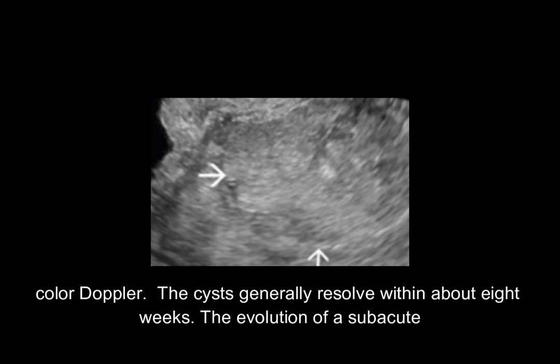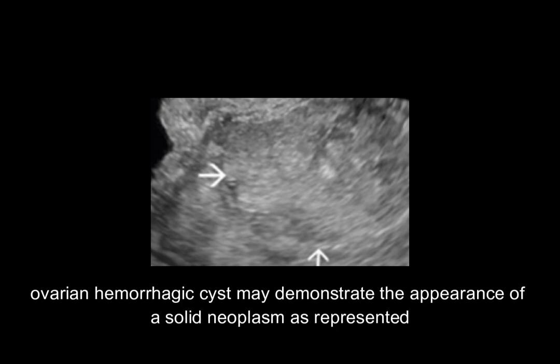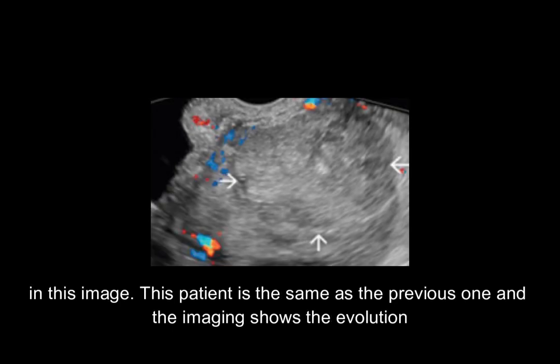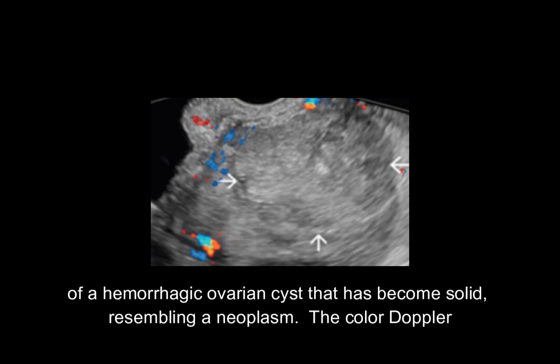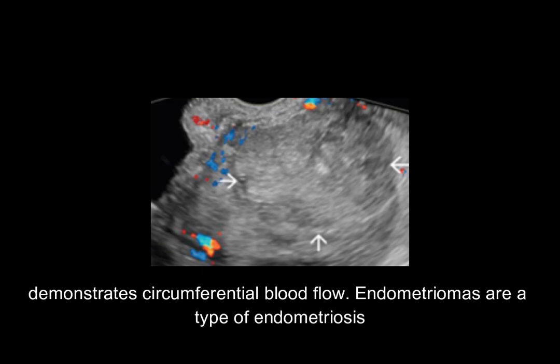The evolution of a subacute ovarian hemorrhagic cyst may demonstrate the appearance of a solid neoplasm. This patient's imaging shows the evolution of a hemorrhagic ovarian cyst that has become solid, resembling a neoplasm. The color Doppler demonstrates circumferential blood flow.